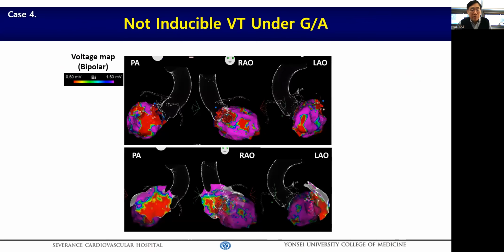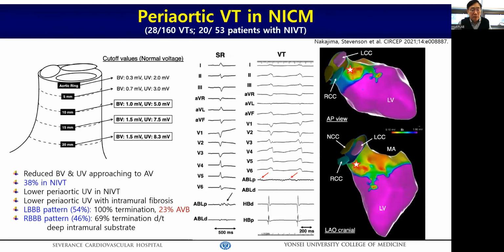We carefully conducted endo and epi map, and unfortunately, we could not induce clinical VT at all. The patient was under gas general anesthesia, which could suppress VT induction. And also, substrate map could suppress clinical VT. Therefore, we had no choice and conducted the endocardial ablation at the LV outflow tract scar area. We finished the case after confirming no further induction of VT with aggressive pacing protocol.